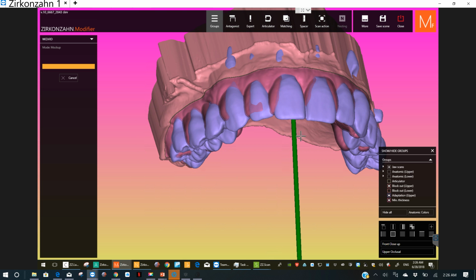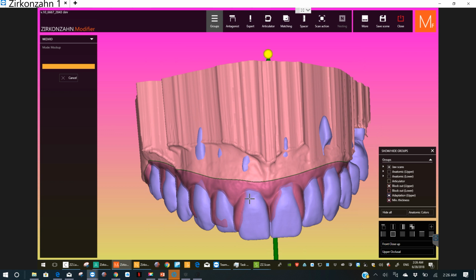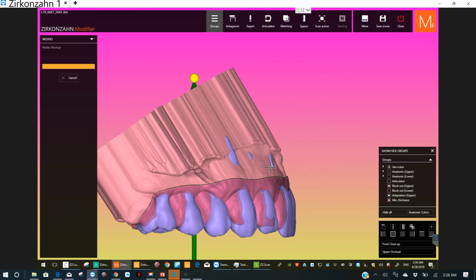And the good news is this makes a nice thing that you can take in and out of the mouth and add composite to or take from. If you put this in and it's off a little bit, you don't have to sit there and try to pack that in the mouth and then way overdo it and then have to cut it back. The patient hates it. So this is a very thin little thing that'll let you do it. I'm not quite sure how we're going to make it, if we're going to mill this or if we can print it.